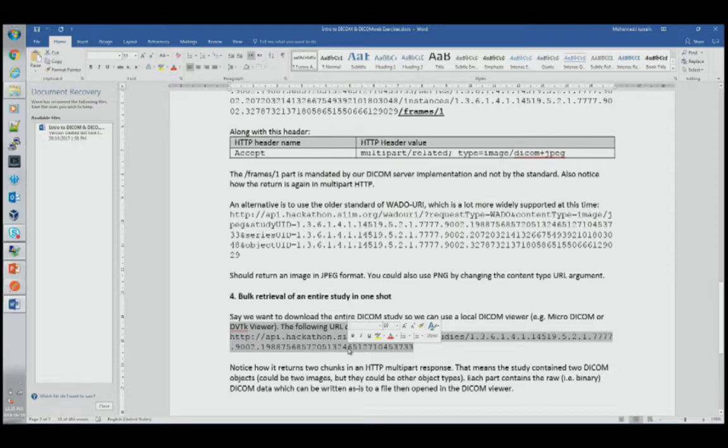Use that very carefully. Some of these studies can be gigabytes large, literally. It all depends. If it's a CAT scan, it's again in the gigabytes, mammogram in gigabytes. If it's a simple X-ray, it's usually megabytes, but be careful with that. Okay, any questions on this before I hand it back to Brad?